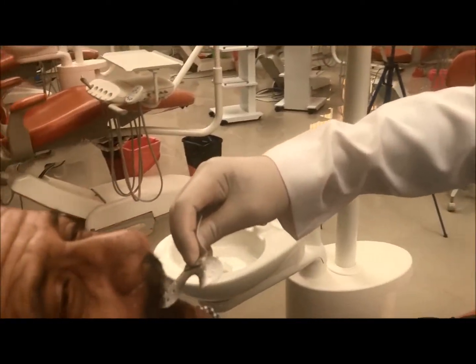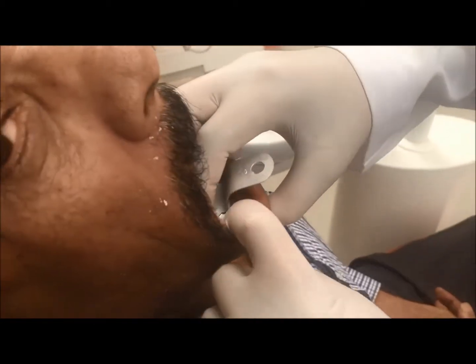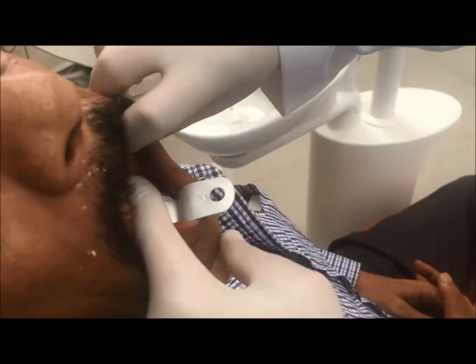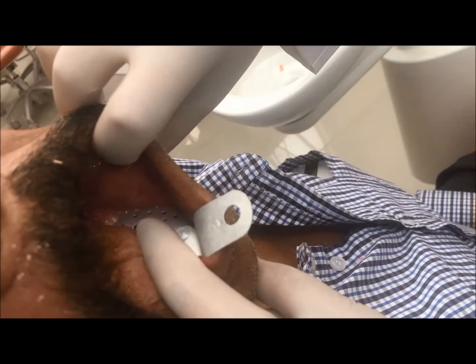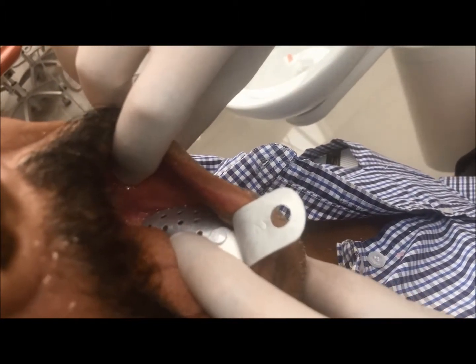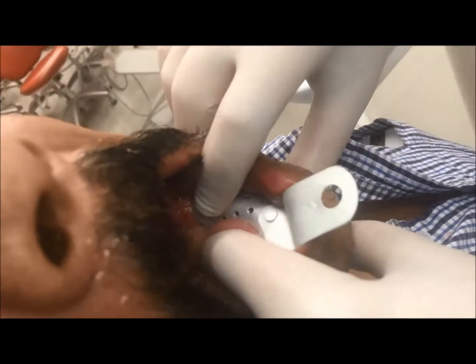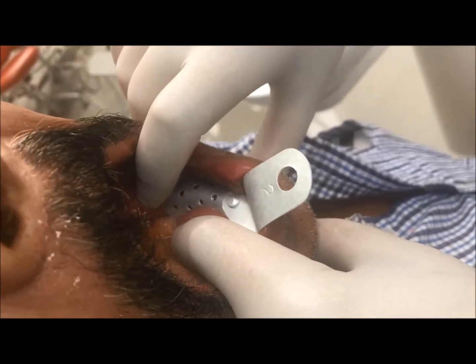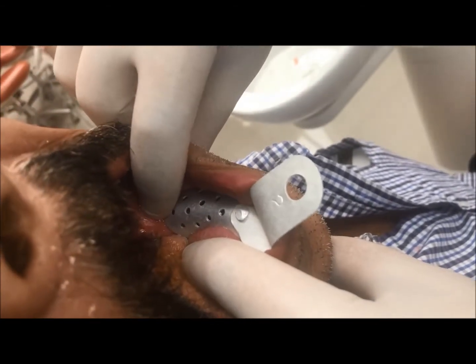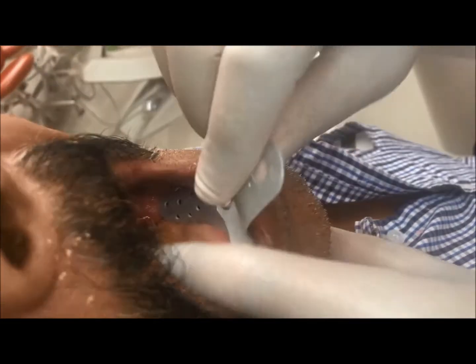I rotate the tray, I insert the tray, and I stand in front of the patient's mouth and retract the cheek. We can see that it is very short at the retromolar pad on both sides — the retromolar pad itself is not covered by the tray. This is the retromolar pad and this is the tray; it is shorter than the retromolar pad by about 3 to 4 millimeters. Thus, this tray is very short.